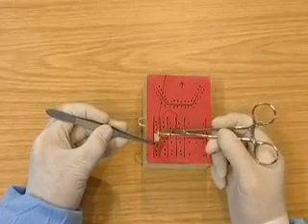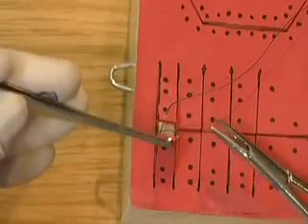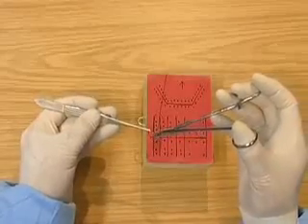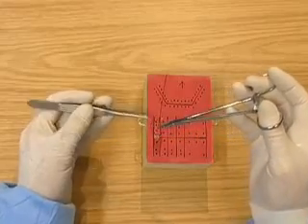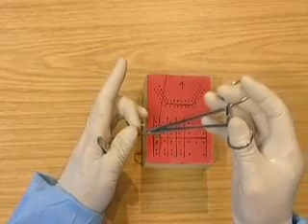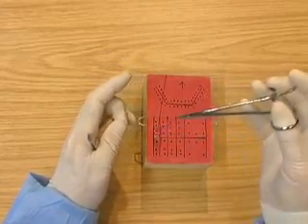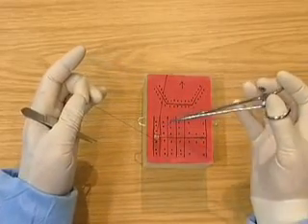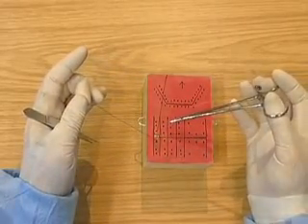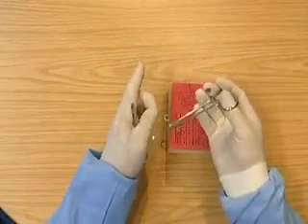Now pick up the tissue again with the tissue pickups. Now take the needle in the needle holders. Parking the tissue pickups.